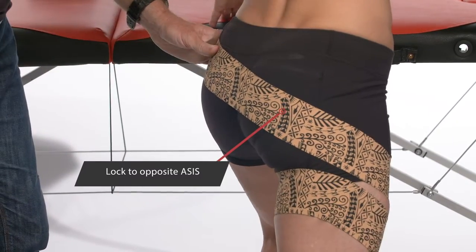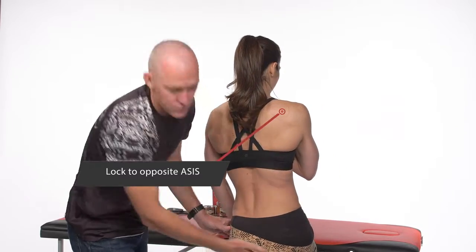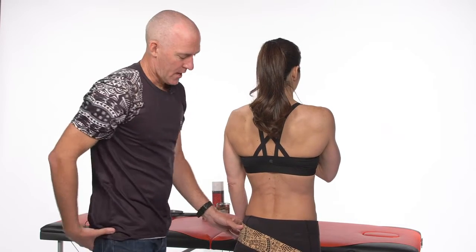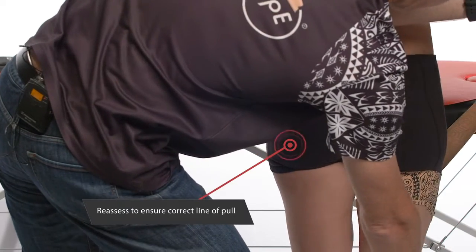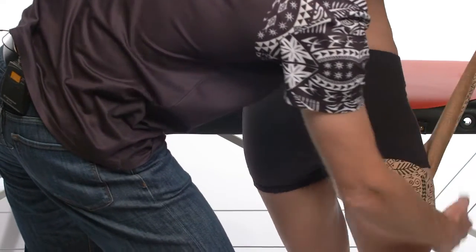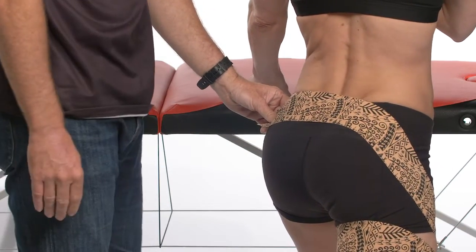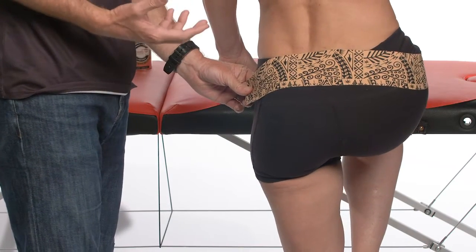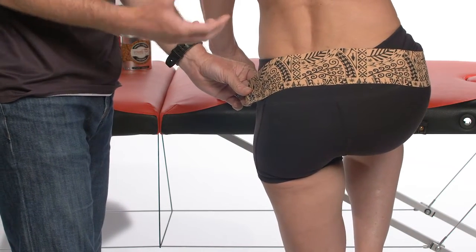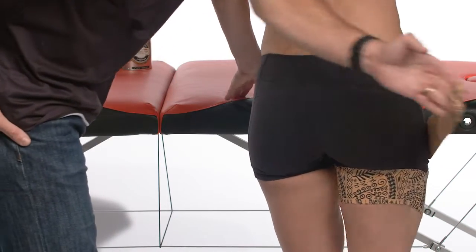So if Erin stands up and tries to take her knee up to her chest, we'll see that this is resisting hip flexion and assisting back into extension, abduction, and external rotation. If we miss that line and come too high — even if we're in the short position but come up high — as the person steps through, we've lost that length change and we don't get that hip extension moment being generated, so we lose that mechanical effect.